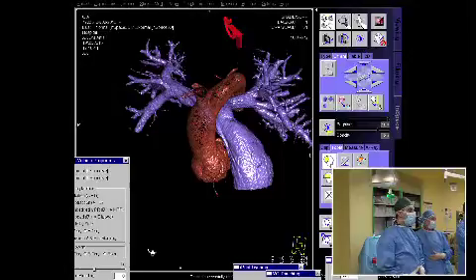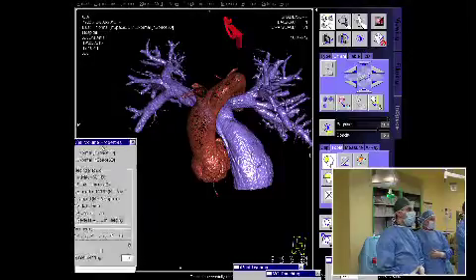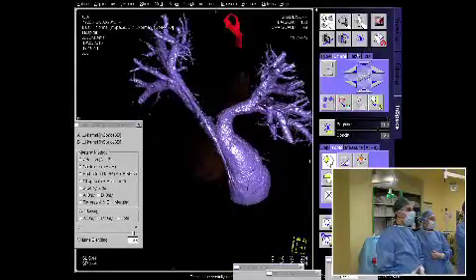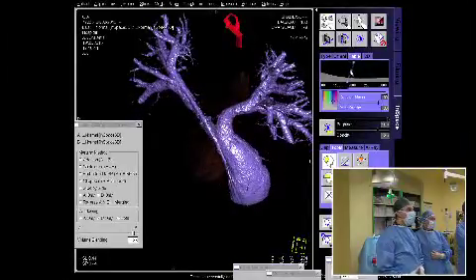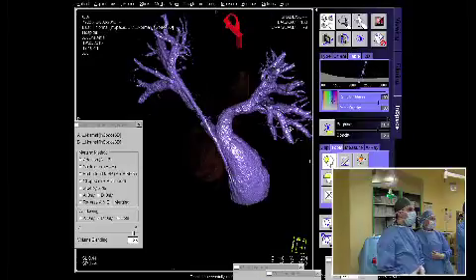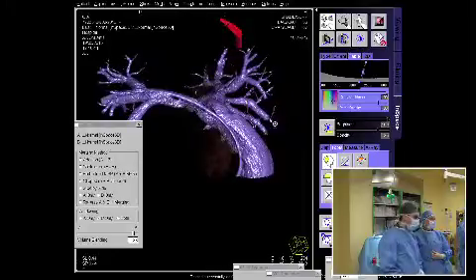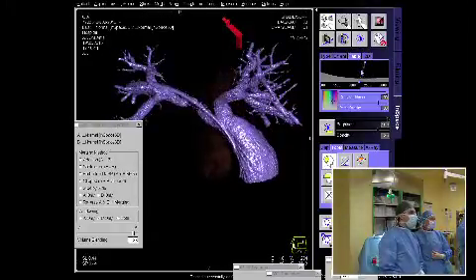Well, John, I think there's the more evident right PA stenosis, but the left PA as well is not normal. Yes, I mean, there's a great kink. I agree with you that I think we need to fix both pulmonary branches. Yes, no question about that. John, do you agree, Gianfranco?